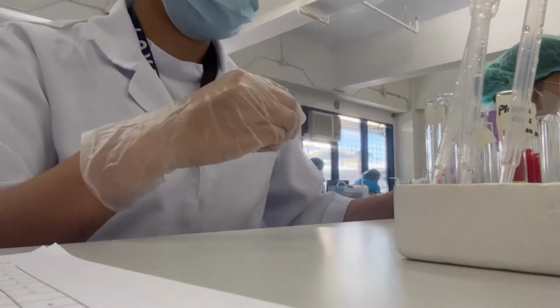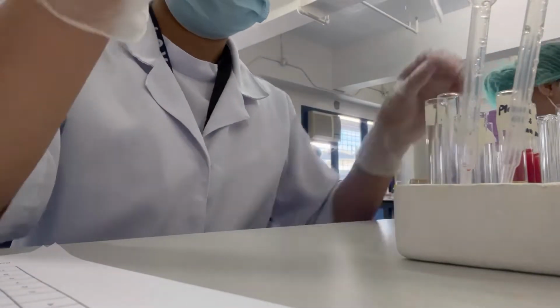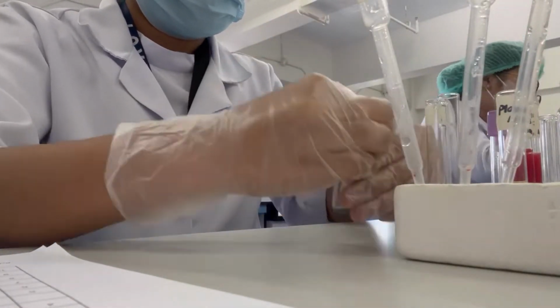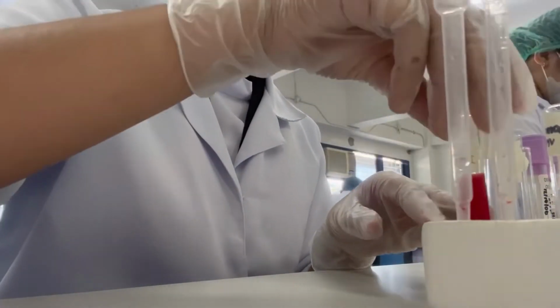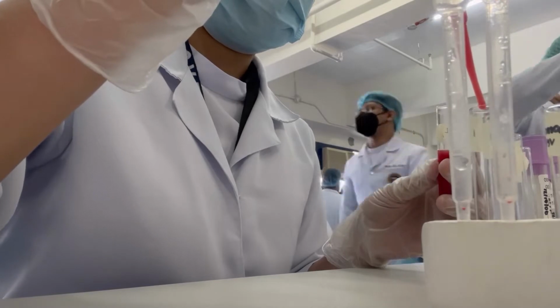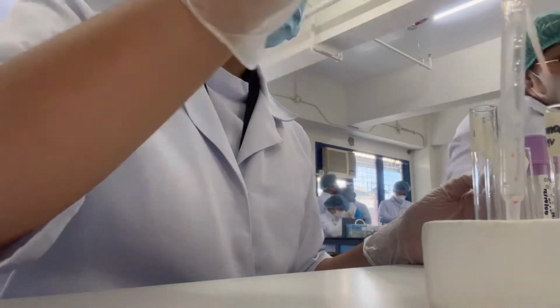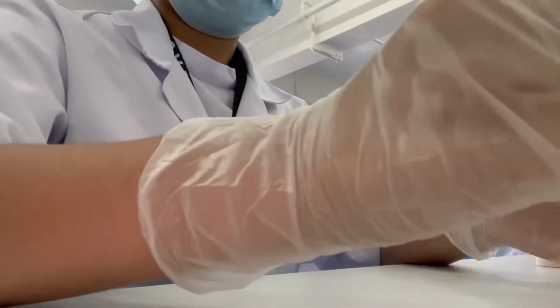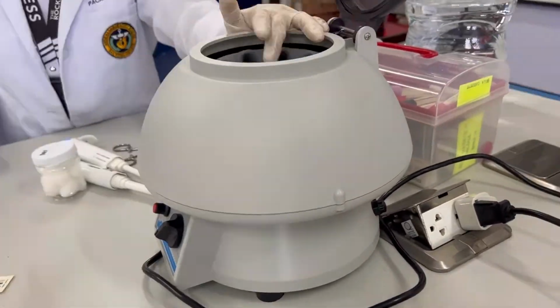For red cells, place 1 drop of anti-A, anti-B, and anti-D in a separate clean test tube. Then, add 1 drop of red cell suspension. For plasma, add 2 drops each of serum or plasma to the test tubes. Then, add 1 drop of A reagent red cells and B reagent red cells. Then, gently mix the contents of the tube and centrifuge for 15 seconds at 3,400 RPM. After centrifuging, read, interpret, and record the results.